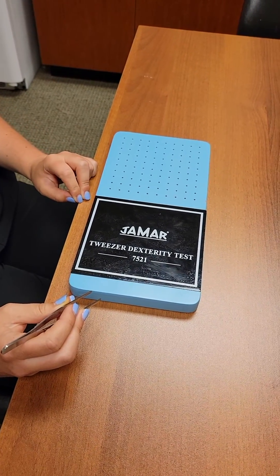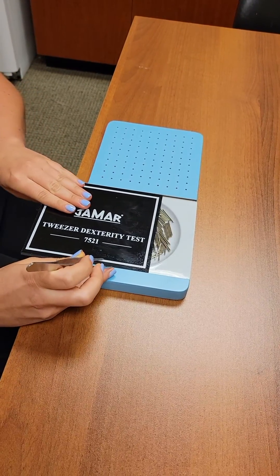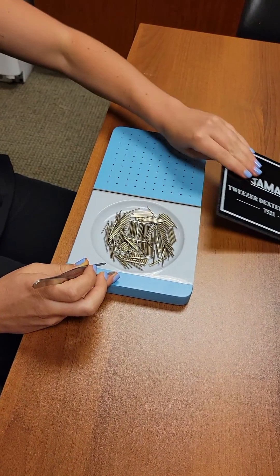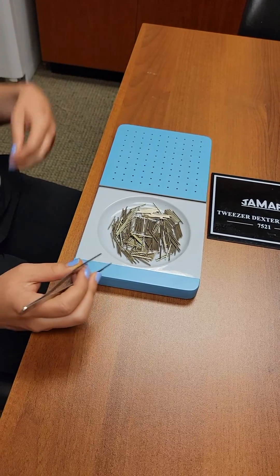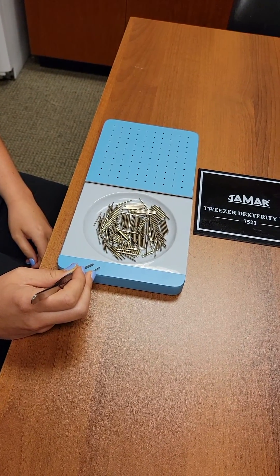Today we're going to go through the JAMR Tweezer Dexterity Test — your test might say O'Connor. This is an older test so it's going to say the JAMR. We're going to test my student's right hand for dexterity.